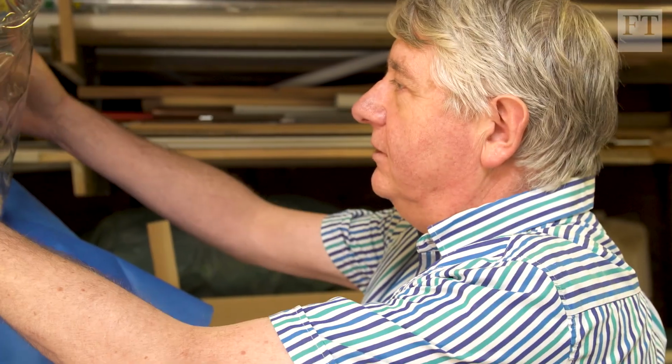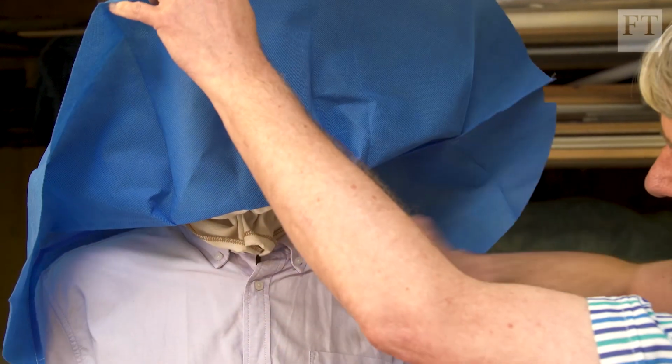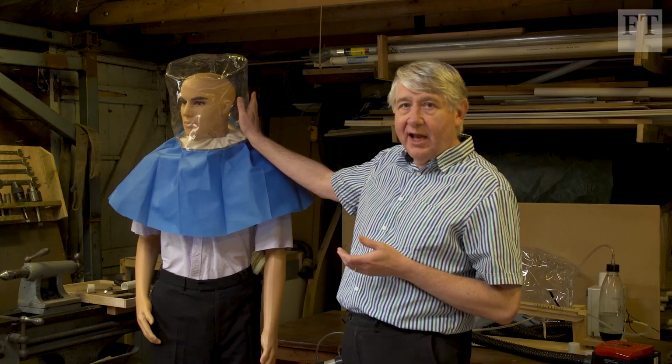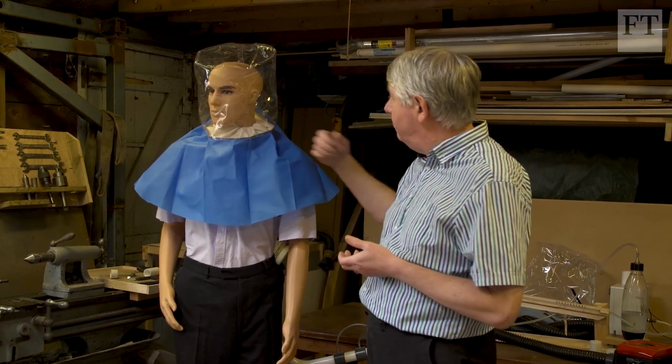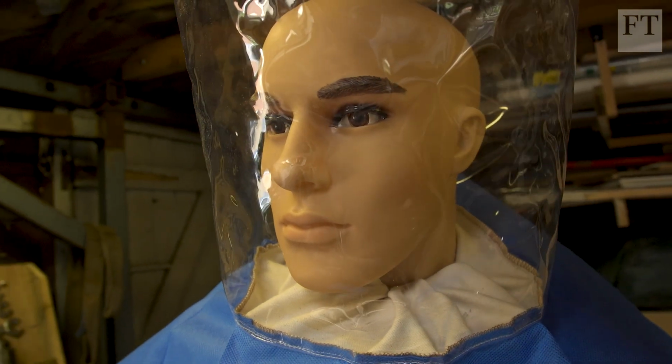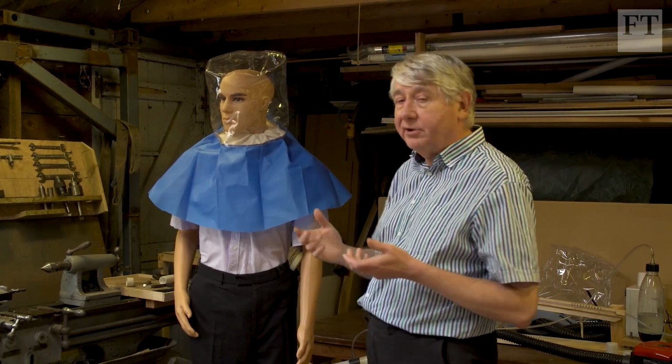So you can see we've got the clear plastic bubble, we've got the seal that goes around the neck underneath, which is tied in here. Because this has inside it what we call positive pressure, that is to say we push air into here and the air permeates out through the fabric at the bottom. That means that anywhere where there is leakage it's of clean air outwards, so it's impossible for contamination to get in. So the positive pressure gives us the positive protection that enables us to work with highly dangerous materials, and also will give that level of protection for healthcare workers against viruses in the air and such like.